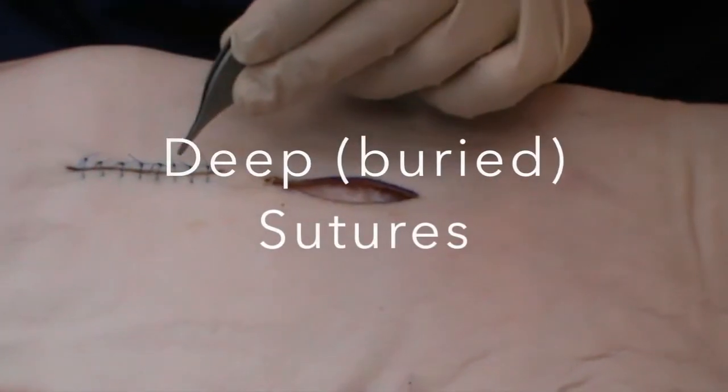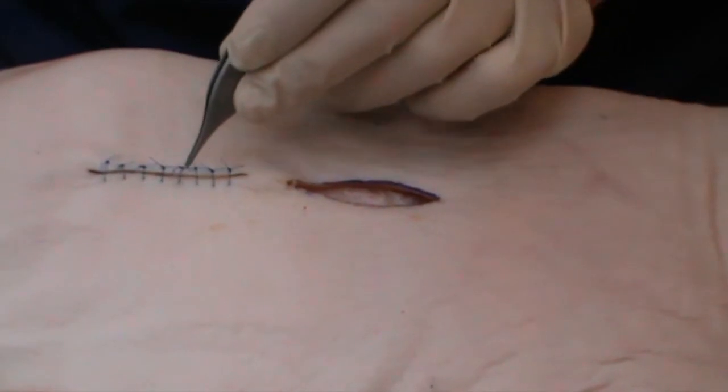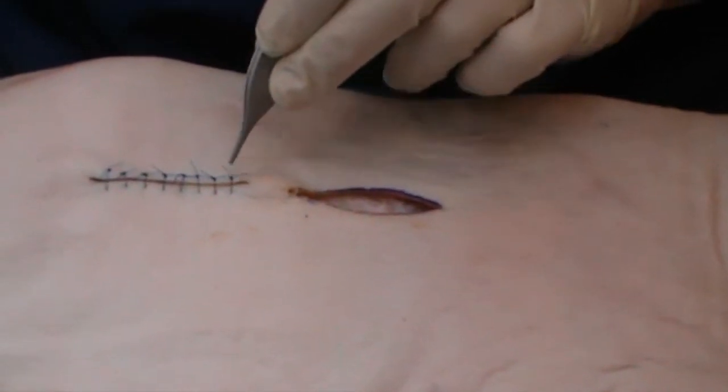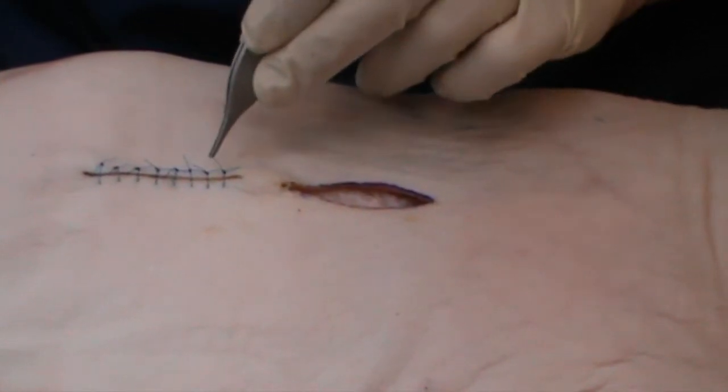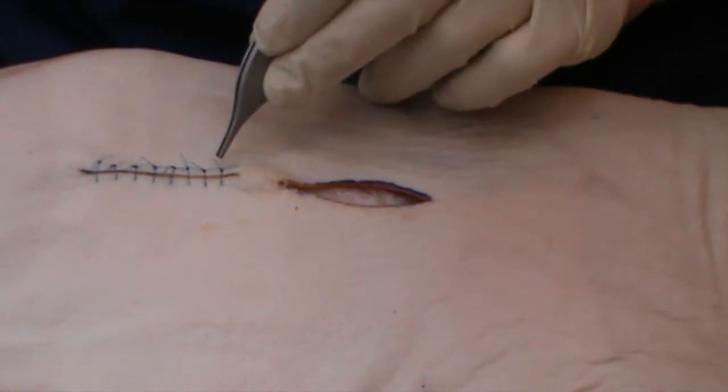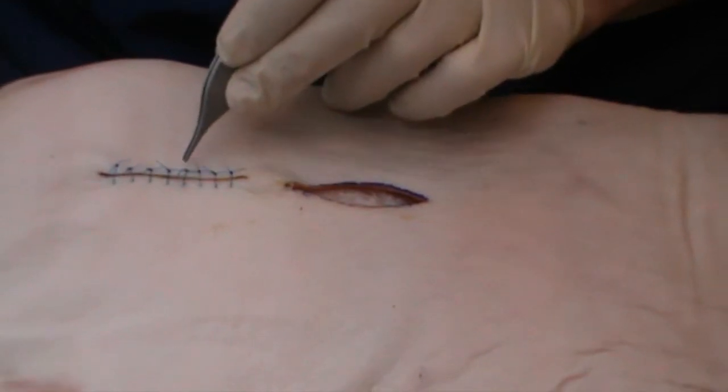Here we have the completed ellipse closed with sutures, equally spaced along the line. The problem with this is that each of those stitches will, if left in for more than seven to ten days, start to tattoo the skin.